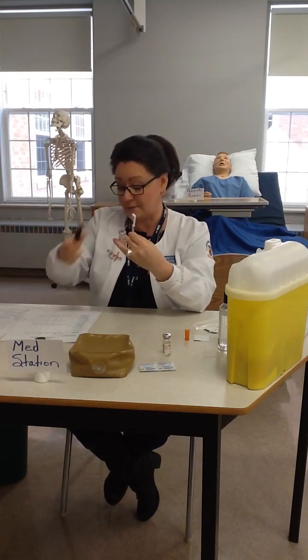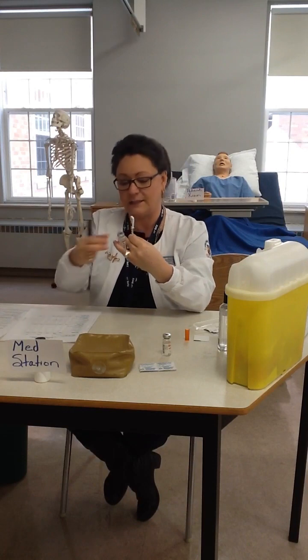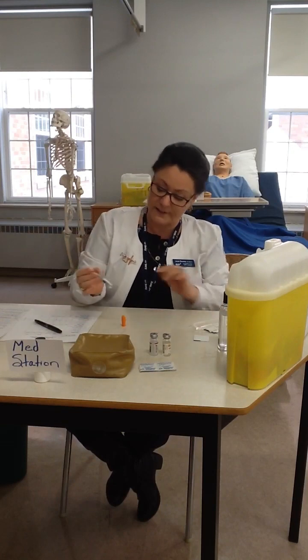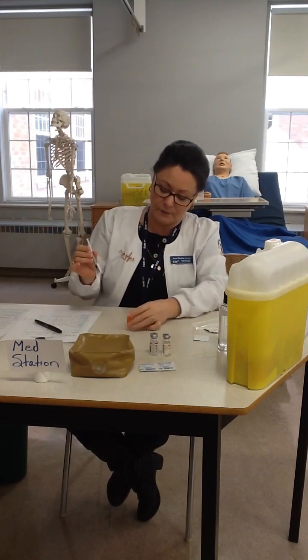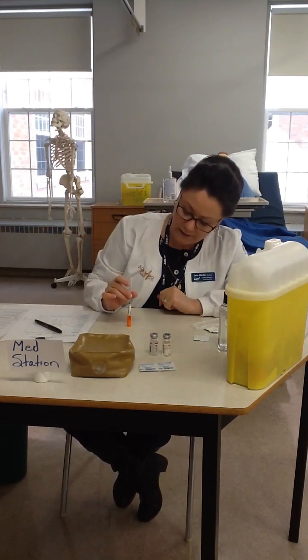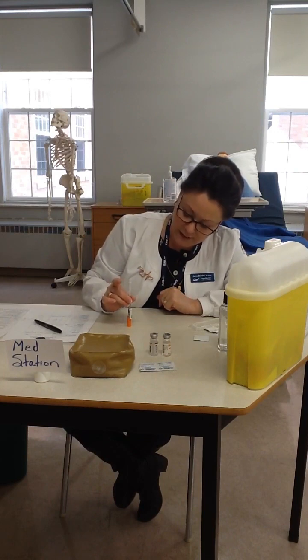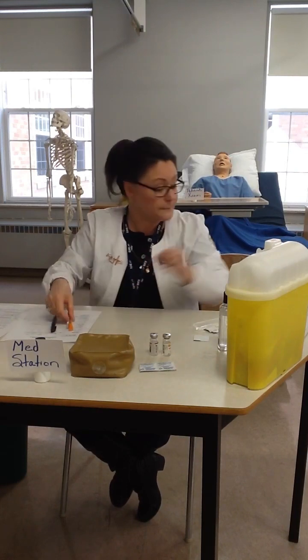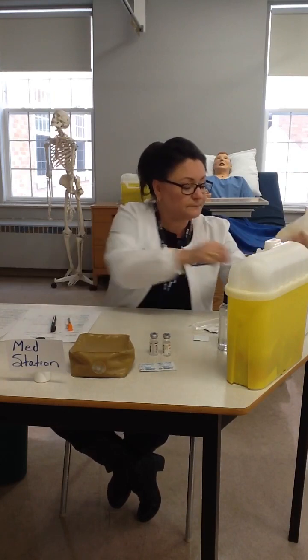And so I'll document that after I've given it, and I will continue to evaluate after I give the medication and then during my shift. So that's my third and final check. I can recap this now. So that little white arm lines up with that little orange opening in the orange cap. I'm just going to push that down. And so my syringe is ready to go. I've done my 3 checks. I know I have the right dose in there. So now I'm going to go ahead and take my gloves.